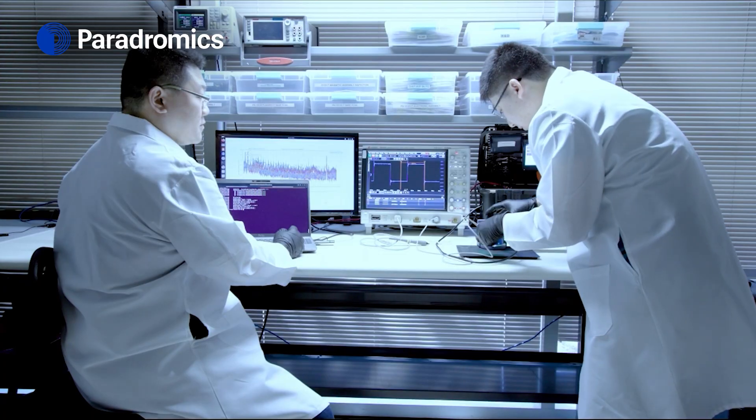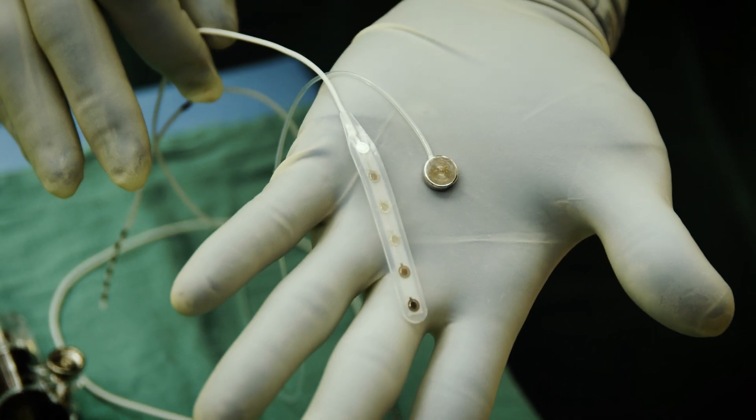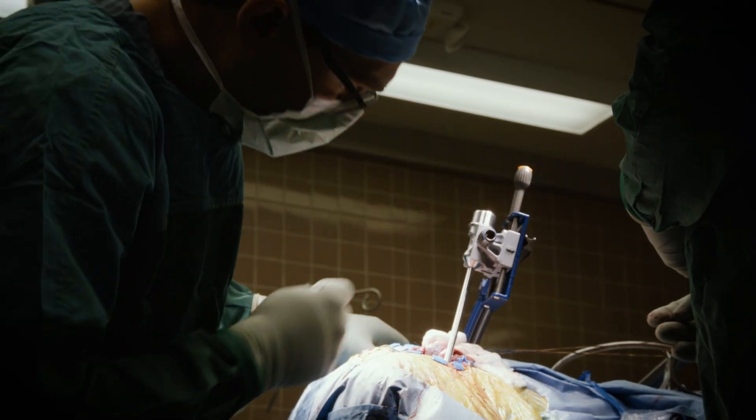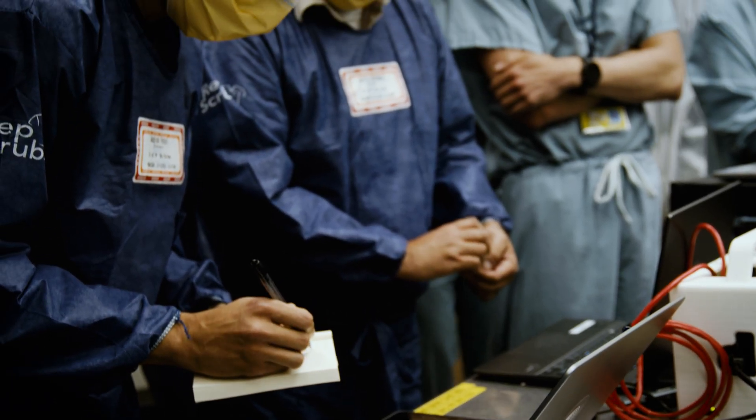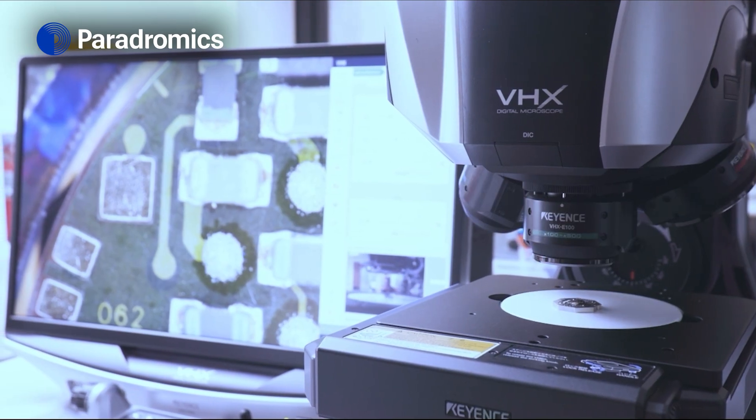This is the first implantation of the Conexus brain-computer interface by Paradromics into a human participant. The chip has over 400 tiny sensors attached to the bottom side of it, and these can be implanted into the brain. Then the signal can be extracted from the electrodes through the chip and output to a device that communicates with the computer.